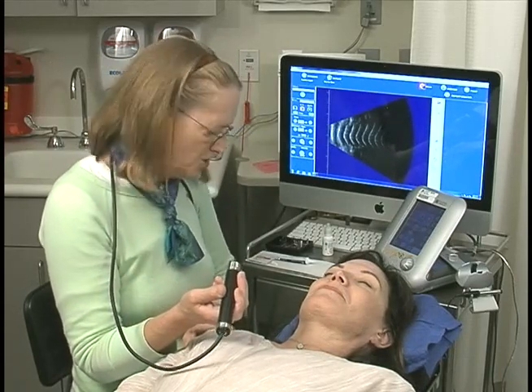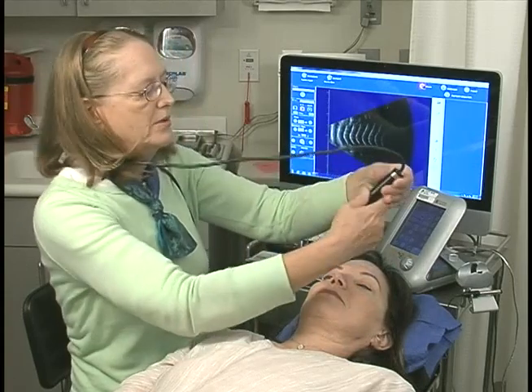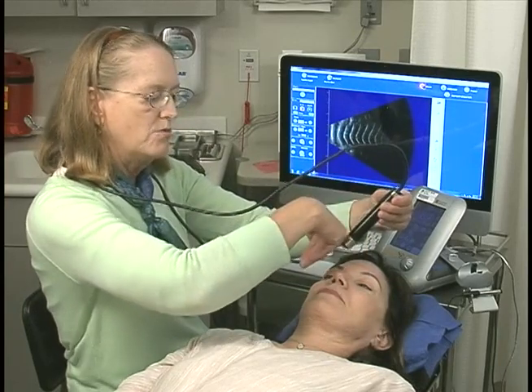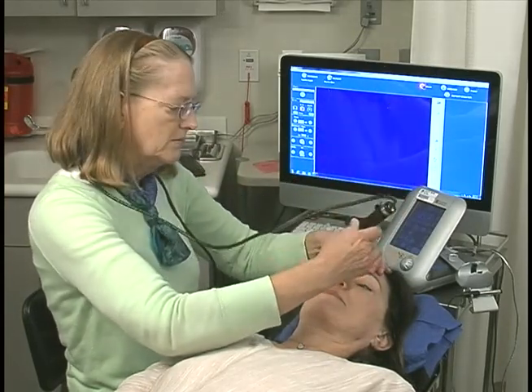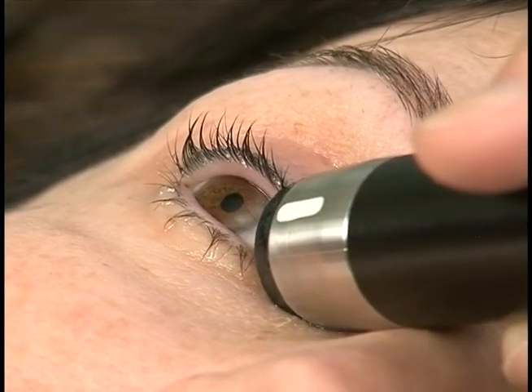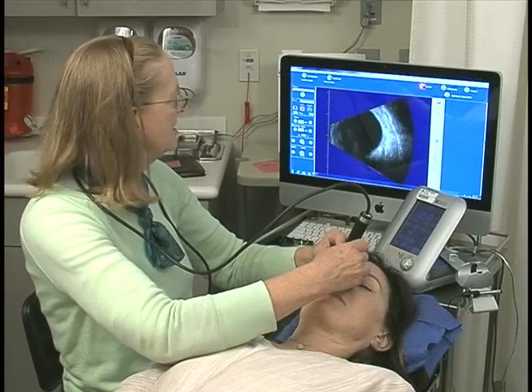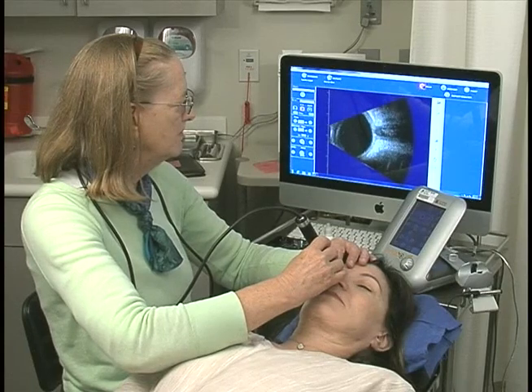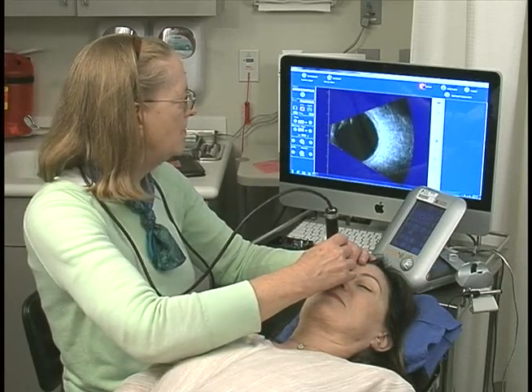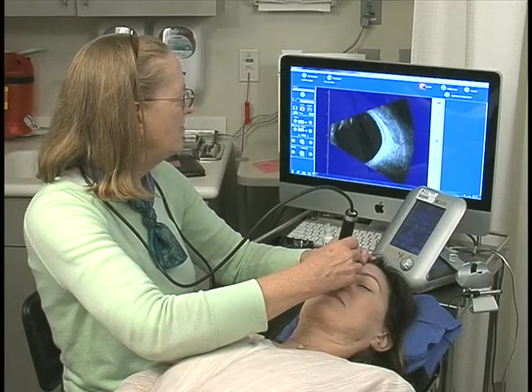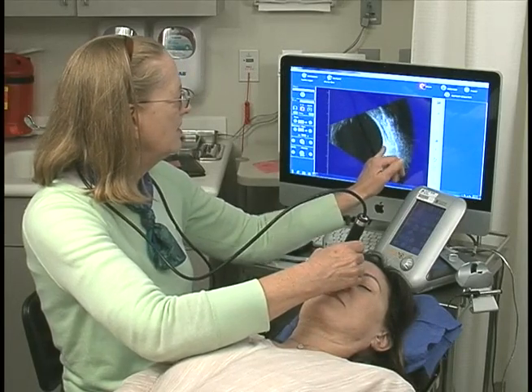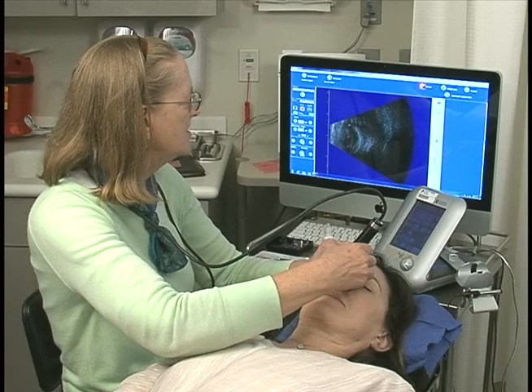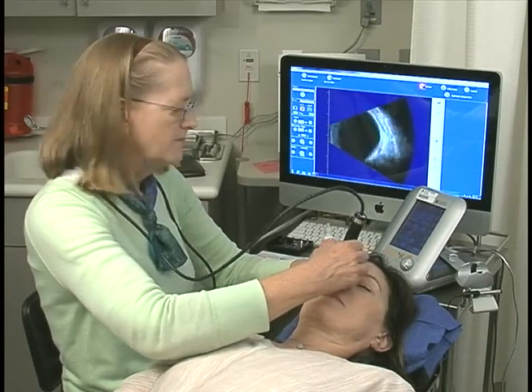So I'd like you to look down at this shoulder for me. I'm going to place the probe obliquely so that the sound will be infrotemporally. I place the probe supranasally, the probe marker is as up as it can be, and I do the same thing. You start with the optic nerve — there's the optic nerve shadow — and then sweep the probe out. This black line right here is the inferior oblique inserting tendon, so you can tell exactly where you are. Now we're at the anterior periphery, all the way out to the iris.